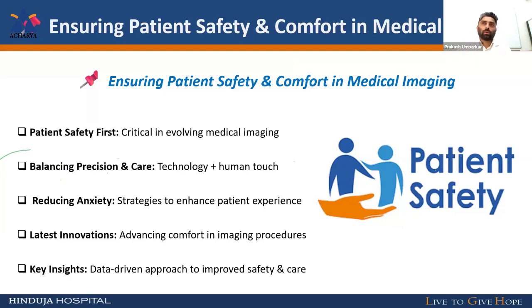Reducing the anxiety. Suppose a patient is coming for an MRI scan. If you see the pediatric patient or the geriatric patient, some patients have anxiety or phobia, and they cannot go into the small bore size. Even in a CT scan, while pushing the contrast and putting in the needle, the patient has anxiety. So we cannot get cooperation for the procedure.